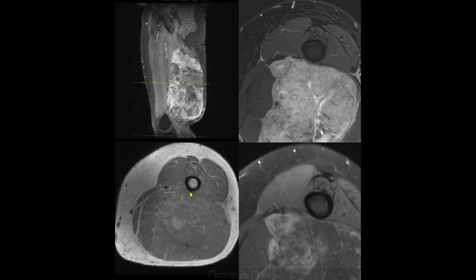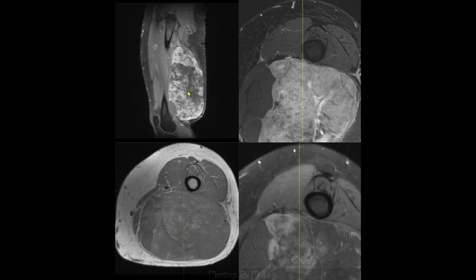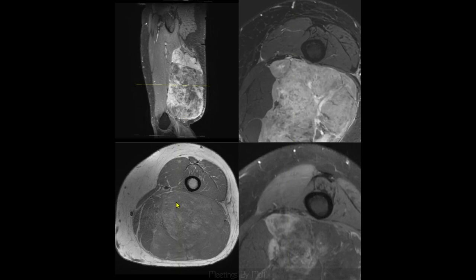And there is a large amount of encasement where they can actually still save that nerve, especially for benign lesions which will wrap around and invaginate the nerve, and they will go ahead and take that out. So the word invasion sounds a little too aggressive. You even want to mention the relationship to a joint and tendons and everything really. They don't usually go into joints, but it's good to look for that.